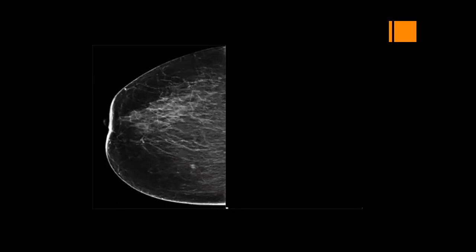Can you tell me what's the abnormality in this mammogram? There is a skin thickening, retroareolar skin thickening. Okay. And a small lesion at the medial part of the breast. Excellent. There is a small asymmetry or a small nodule in the medial aspect of the breast.